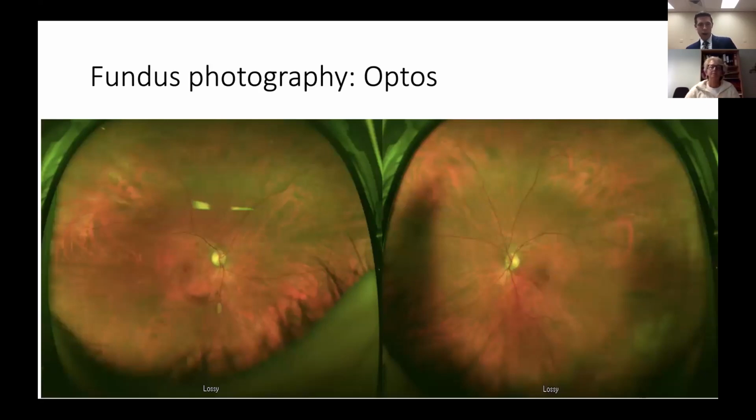So right eye, actually here on the left hand side, and then left eye over here, we can see that hemorrhage that was kind of obscuring her fovea is now gone. And again, in the right eye, you have those more peripheral findings here, but overall just some remnant dot blots, but the body's done a good job of getting rid of that kind of double ring of blood.